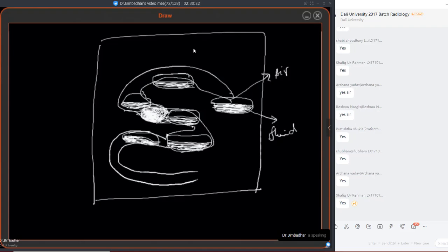So you are looking at an intestine just like the way I drew it. This concept is quite simple. The recognition is also very simple, but the physiological mechanism, yes, is difficult for you to diagnose. The bowel loop obviously has to look something like this because it is present down like this, in all the gravity-dependent areas, and the peristaltic movements happening are what cause such multiple air fluid levels.